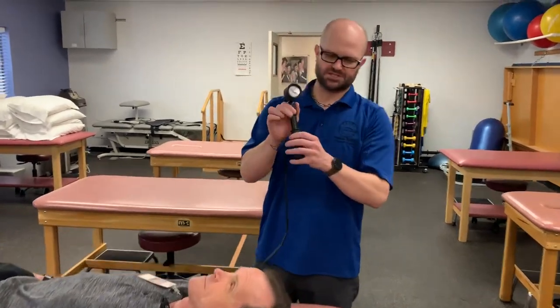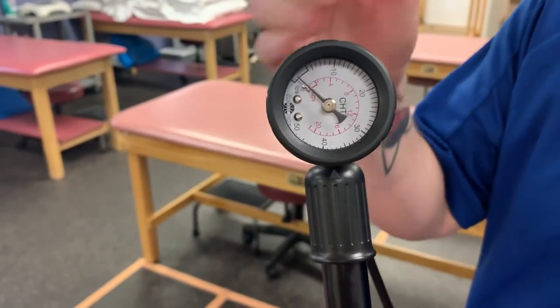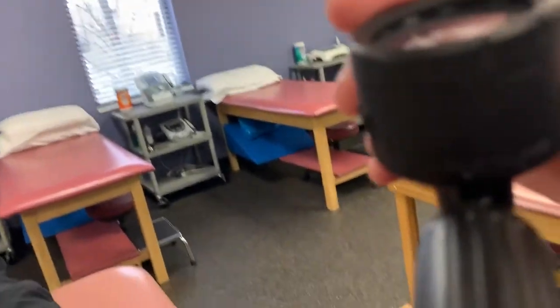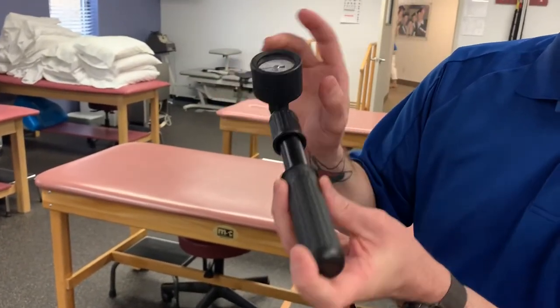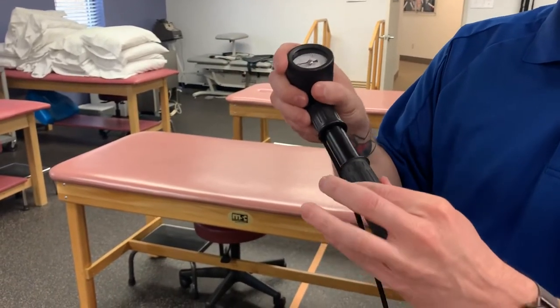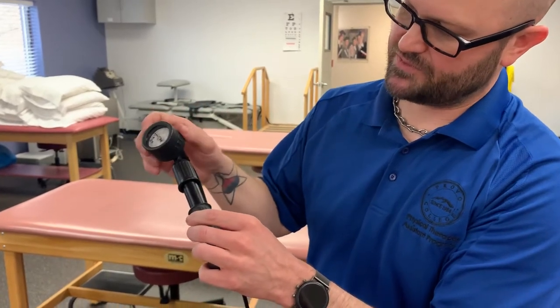On our little pump — it's just like a bike pump — there's a little dial on the front that turns and allows us to either pump or release. There are some writings underneath there: one says 'pump.' If you turn it to the left or counterclockwise you get 'hold,' which means no matter if we pump or not the sled and pressure are not going to change. And if we go clockwise from pump we get 'release,' which is obviously how we release that pressure.